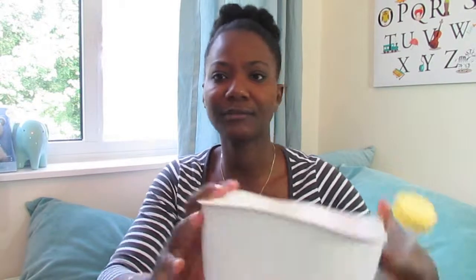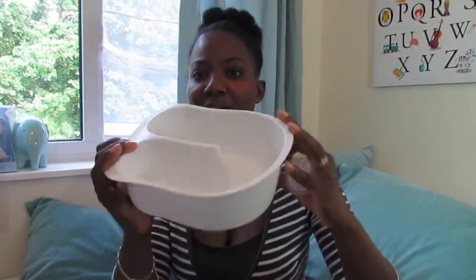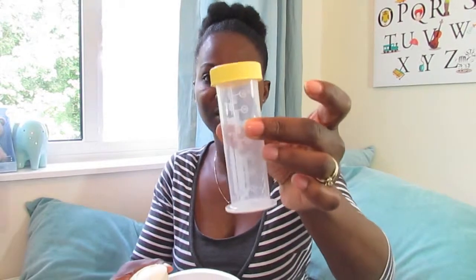I did purchase this kit off Amazon in the US — I'm actually in the UK, but I had a friend bring it for me. It's by Medela. It has a container and came with six of these bottles.